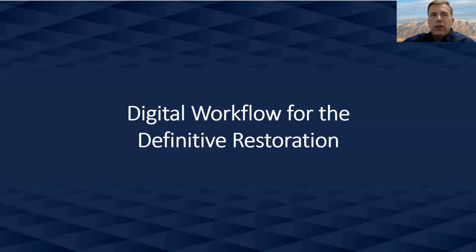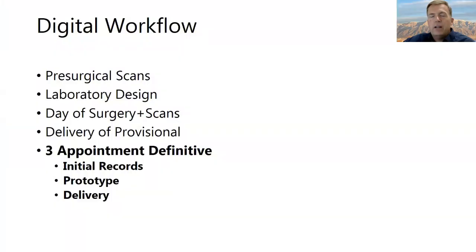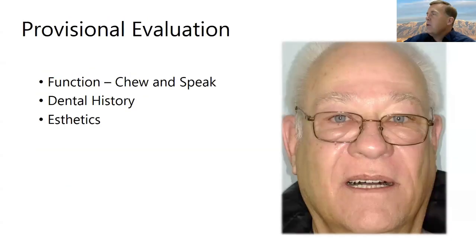So once the patient's all healed, now we're ready to go to the definitive restoration. And this is our last 3 appointments. So the patient's been living with our restoration for a while, and we want to really understand what they like about it and what they want to change. Again, we've been working through it with them and making adjustments and getting it where it needs to be, but we want to get a really good feel for how they're doing with their speech, their chewing, all that, because we want to make the majority of the rest of the changes between now and the next appointment, which will be the prototype.